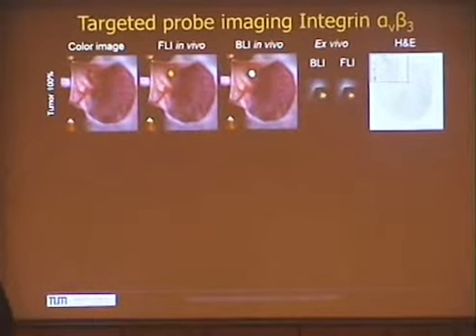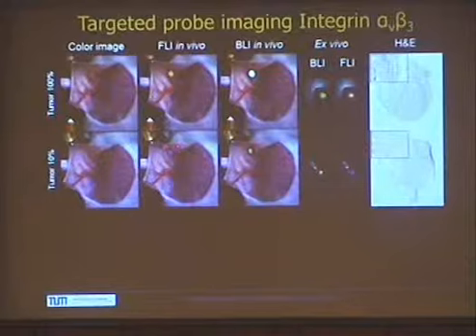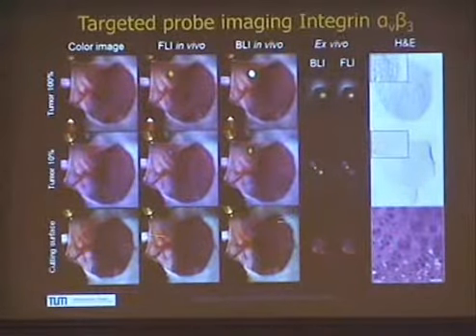And I can show you some examples of the concept. So we're working together with surgeons. In this particular case, we had a tumor here implanted in a mouse. We used an agent that targets integrin alpha V beta 3. And here you have the fluorescent signal from the tumor. Here's the tumor anatomically. And the tumor cells were also expressing bioluminescence, so they were naturally also emitting light. So this is the tumor at 100%. And then we told the surgeon, just take 90% out and leave 10% just to show that we can still see the tumor. And here is the tumor after 10%. And then after complete removal of the fluorescent signals, we could show with histology that there was no tumor left.